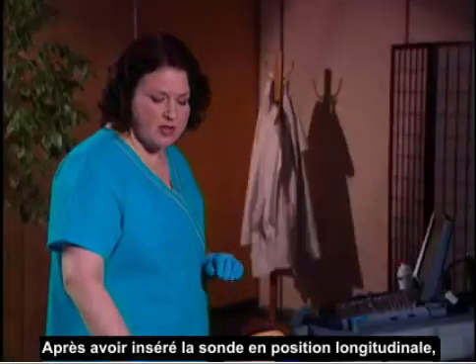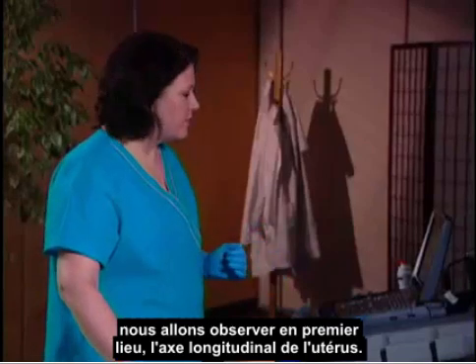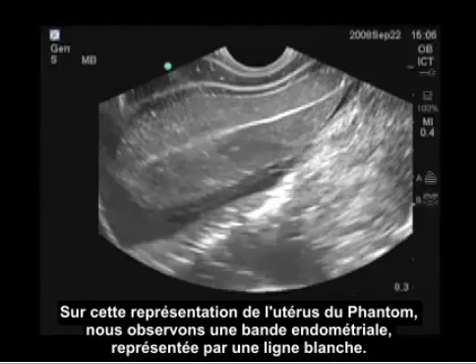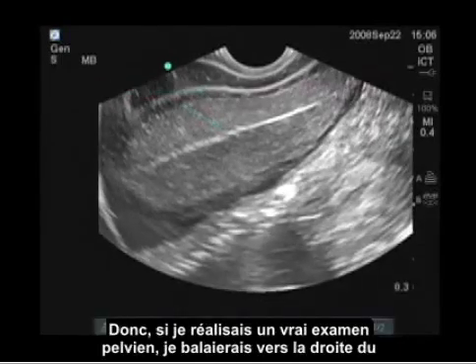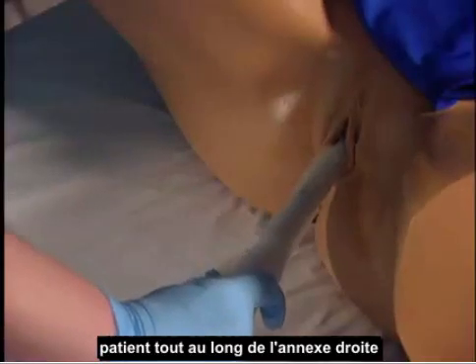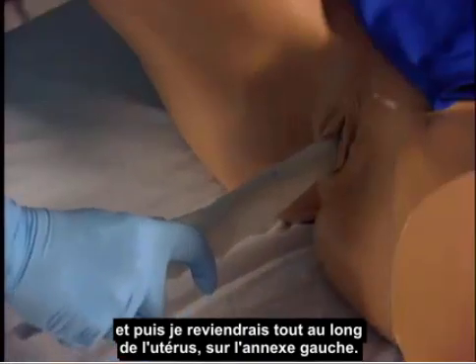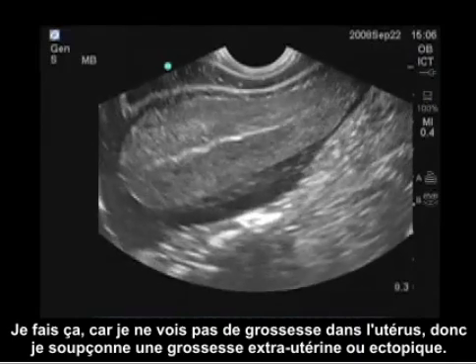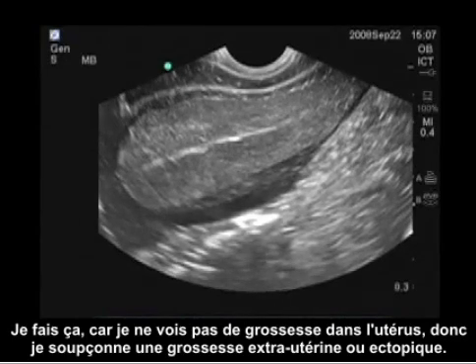After inserting the transducer in a long axis view, the first thing we see is a long axis of the uterus. In this phantom, we see an endometrial stripe represented by the white line. I would scan to the right of the patient all the way through to the right adnexa, then back all the way through the uterus. I don't see a pregnancy inside the uterus, so I'm suspecting extrauterine or ectopic pregnancy.